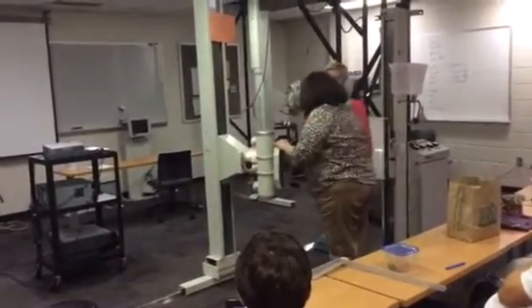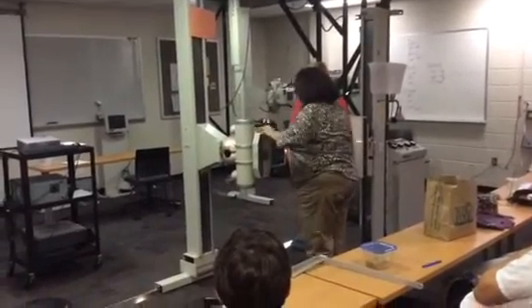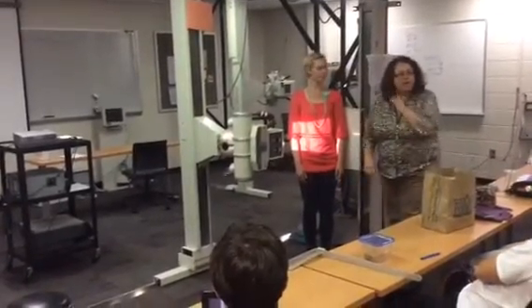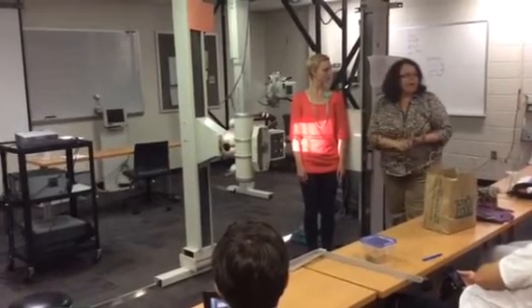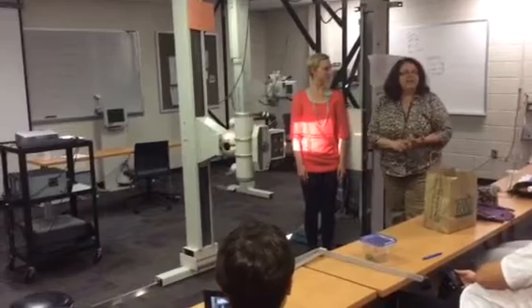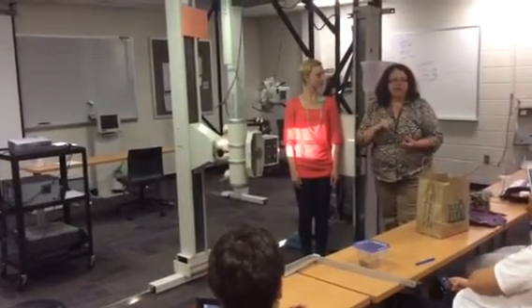Central ray on this one. Find the iliac crest, about 1 inch above. So we got a theme going here. AP lumbosacral, lateral lumbosacral, lumbar oblique. Your central ray is going to be 1 inch above the iliac crest. That's all of those, 1 inch above the iliac crest.